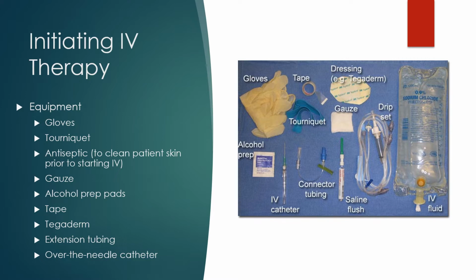So before we get started, here's the equipment that we're going to need. Luckily, most facilities have the same equipment in their kits. So most of the time it's going to look very familiar. You have a kit in your red bag that we're going to pull out in lab this week. And one of the first things that you need is that tourniquet.